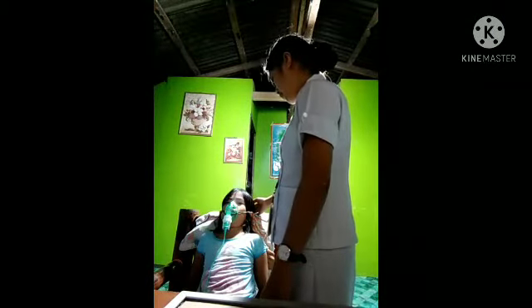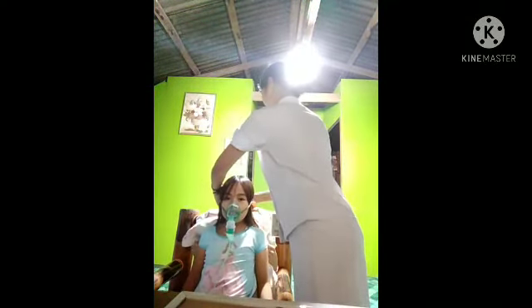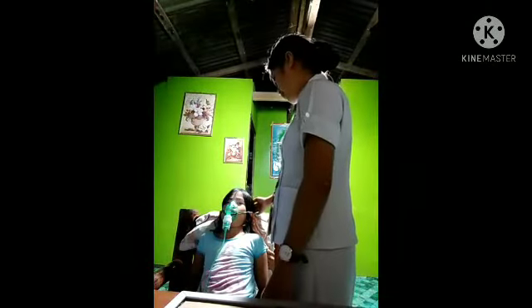Encourage the patient to breathe the nebulized vapor through the mouthpiece. This is because breathing through the mouth, or normally with a mask, helps the medication travel to the lungs for maximum effect. Remain with the patient until all the solution has been nebulized. Instruct the client to continue the treatment until he or she can no longer see a mist and exhalation from the opposite end of the mouthpiece or vent holes in the mask. This is because lack of mist ensures that the client has inhaled the entire dose.